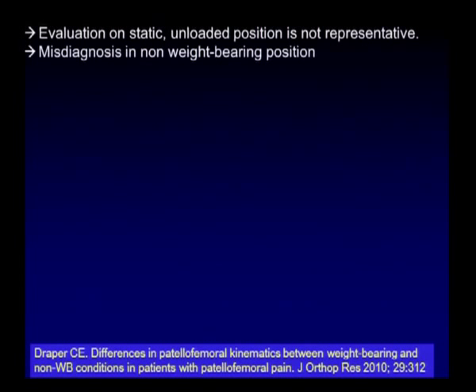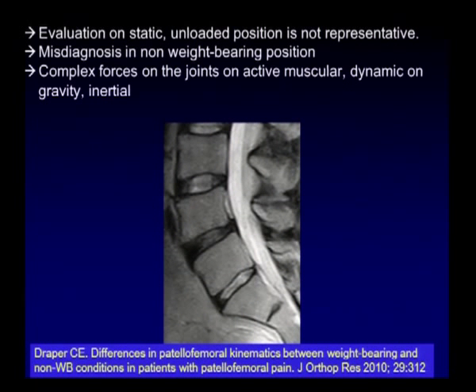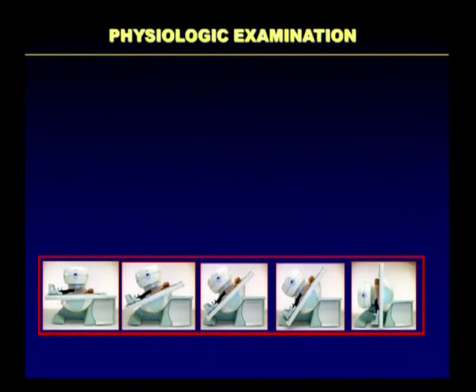It might be a pitfall, or we might overlook certain morphologic findings in a non-weight-bearing position. We know that in a loaded position, there are complex forces on the joints, including active muscular, dynamic, gravity, and inertial forces. So as we have seen in this example, the morphology changes completely in the proper analysis.